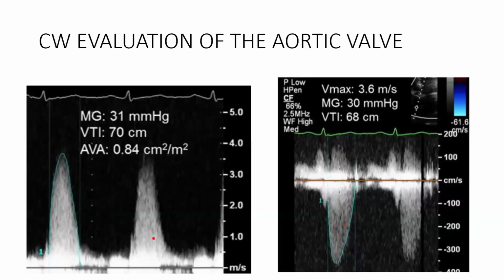But in this scenario, the next line for this patient, because it's symptomatic, will be more of computed CT angiography for this patient. Okay. Did you mean CT scan or CT angiography? Cardiac. So a CT scan looking at the aortic valve, that's what you are suggesting? Yes. Or you are talking about angiography, CT coronary angiography? It's CT coronary angiography, rather. Oh, okay. All right. Thank you very much.